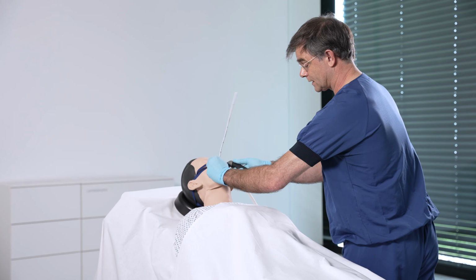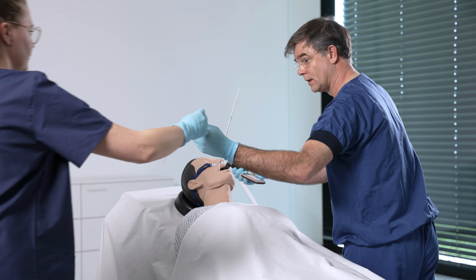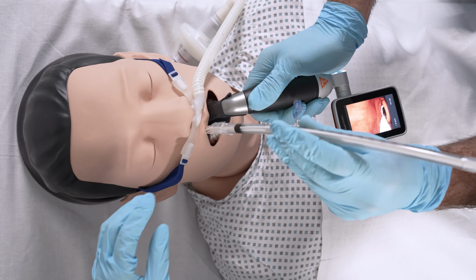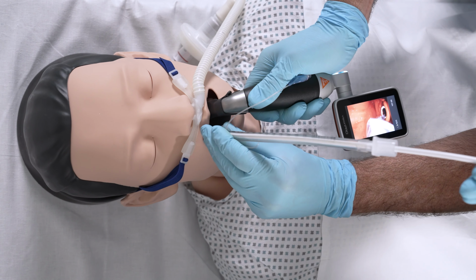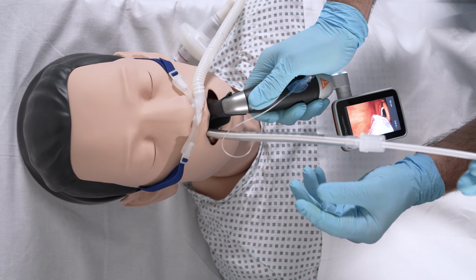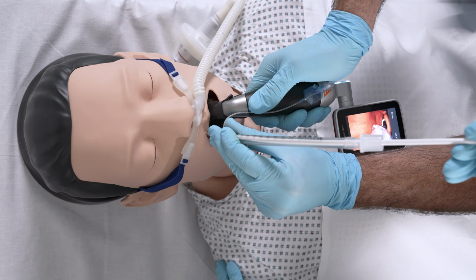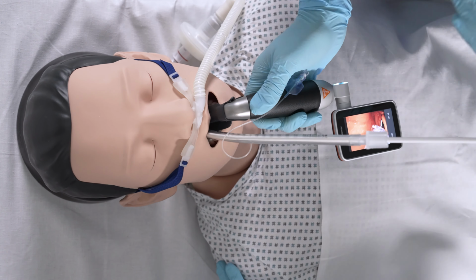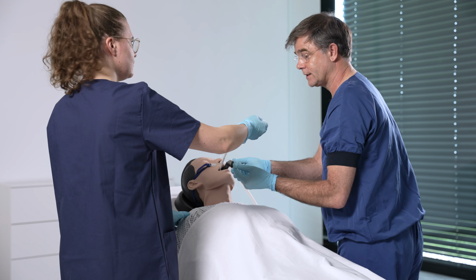And when we confirm that the bougie is in the trachea, we just need a tube. And then you can help me push it around the bougie. Yeah, there we go. If you hold the bougie, we can carefully intubate the patient. And this is maybe the moment you give a little bit of propofol to make the patient comfortable, and the patient can be intubated awake. This is the idea. Thank you very much.